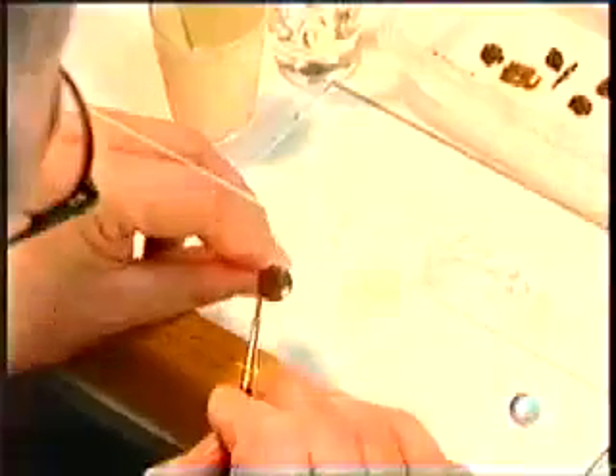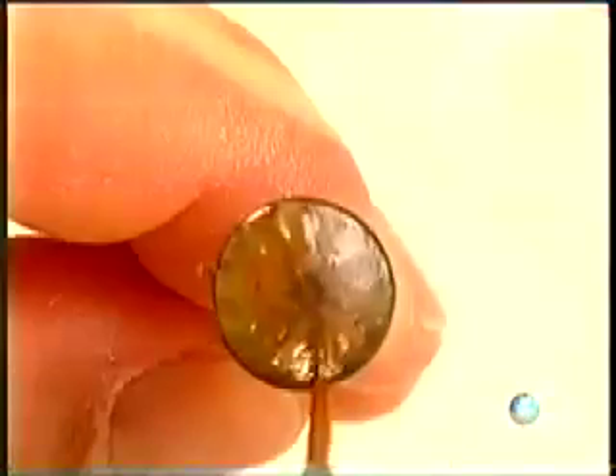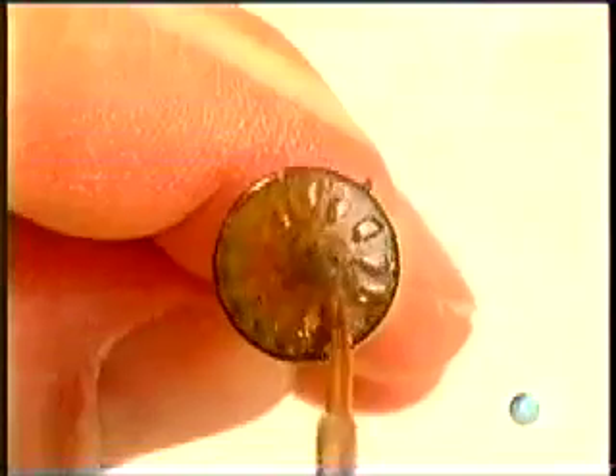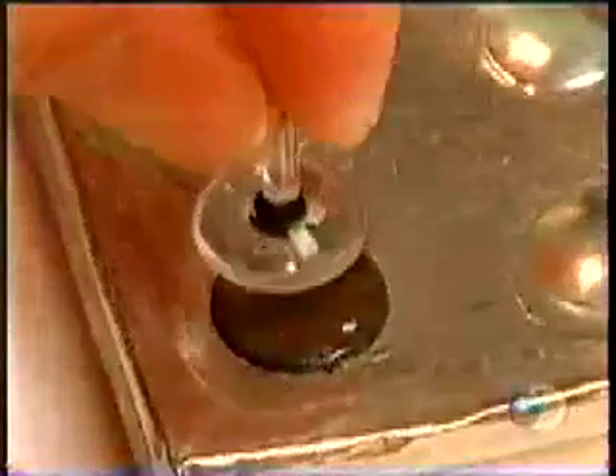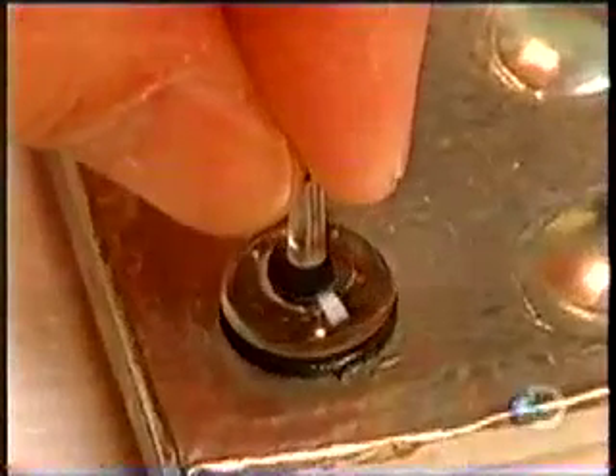But first, they have to make the iris. They take a curved black acrylic disc and paint it as realistically as possible with high quality artist oils. The patient has to be present so they can match the real eye. Next, they glue an acrylic cornea with an appropriately sized pupil onto the painted iris. At this point, the artificial iris is half an inch in diameter.